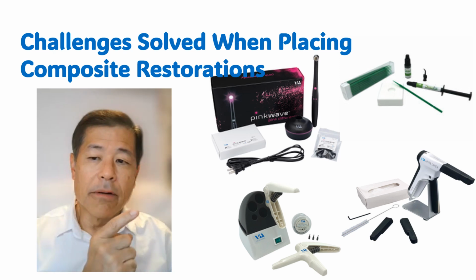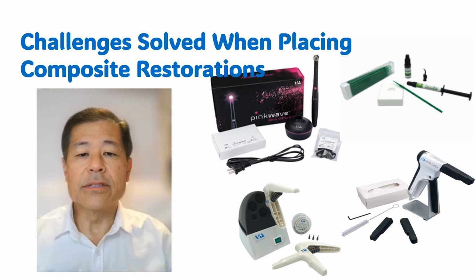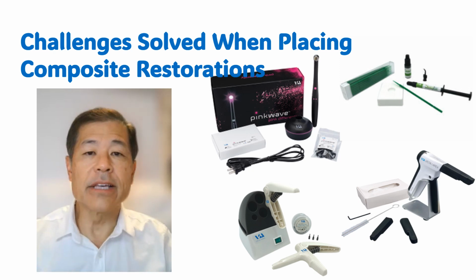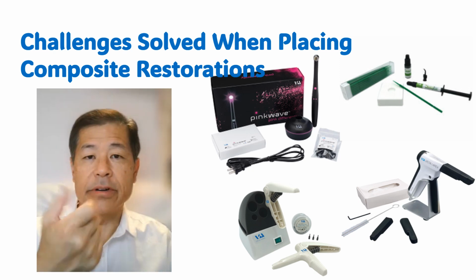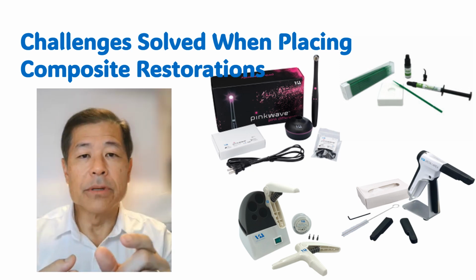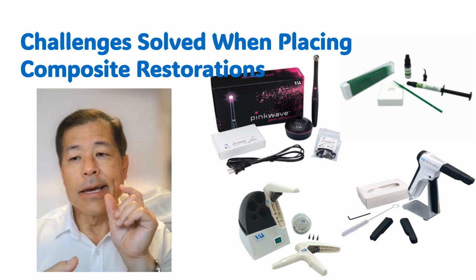A little bit further to the edge of the slide, on the other side of the benchtop composite warmer, we have the Phasor. The Phasor is a composite gun, so that's how we deliver our composite right out of our little compules. So I use compules because they're just easier, it's cleaner, and single use.